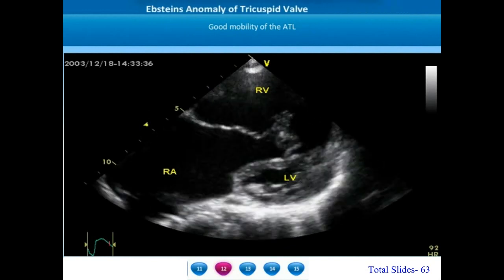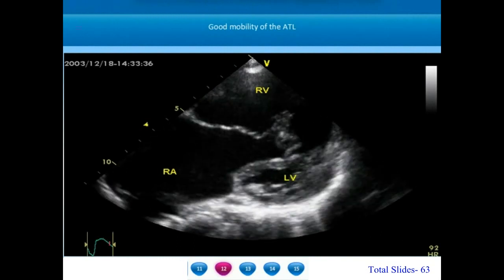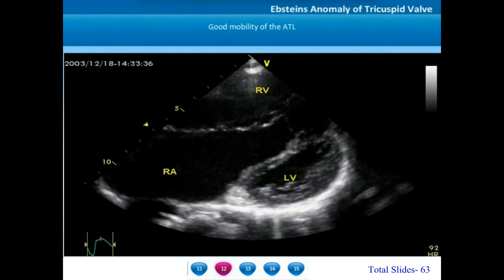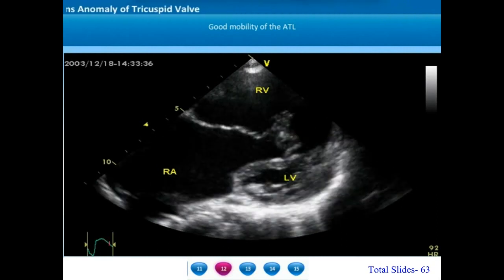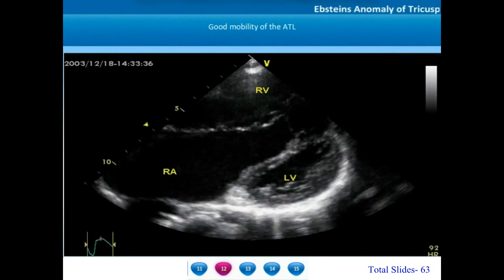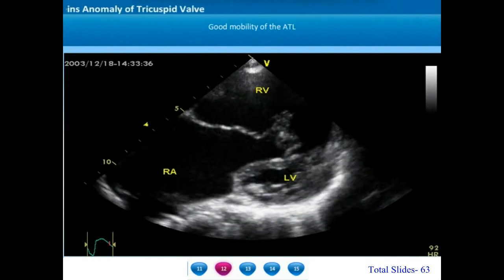On the parasternal short axis view, we can appreciate the dilatation of the right atrioventricular junction, the normal attachment of the anterior tricuspid leaflet, a significant apical displacement of the septal tricuspid leaflet, good mobility of the anterior tricuspid leaflet, and failed delamination of the septal tricuspid leaflet. Whenever the right ventricle gets dilated enormously in Epstein's anomaly, the interventricular septum may start moving into the left ventricle in diastole, leading to a squashed appearance of the left ventricle. This may even impair left ventricular systolic function in late stages.